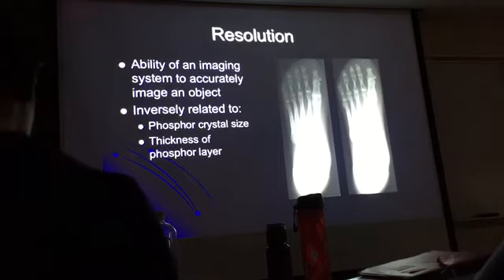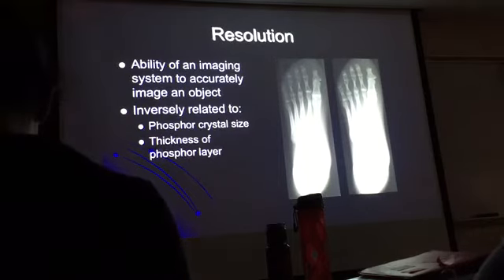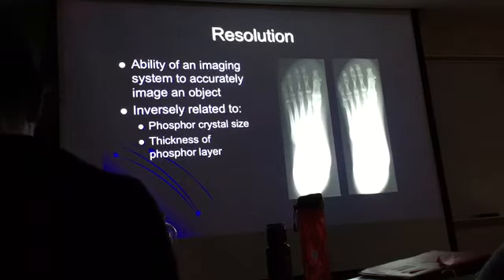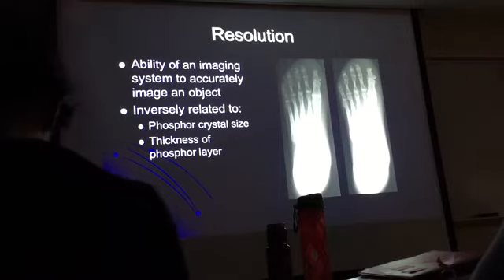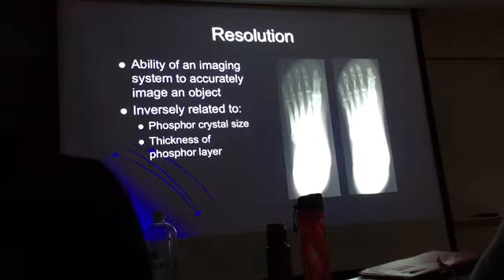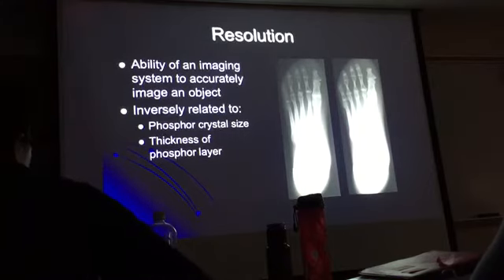You guys were in my lab last year, so I know. Imaging system is a combination of screen and film. Yeah, I looked at the right one, and I see that the paper is not blackened out as much as the one on the left. Using measurement, numerically.